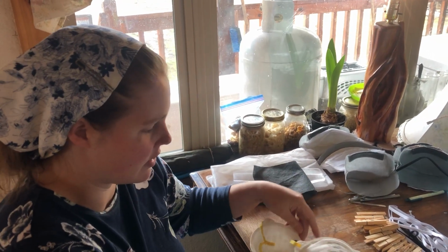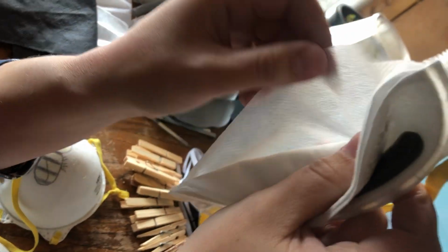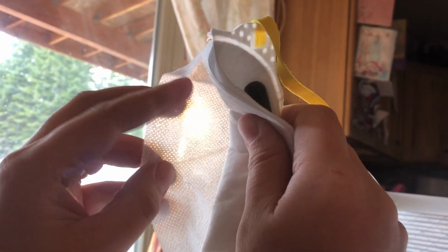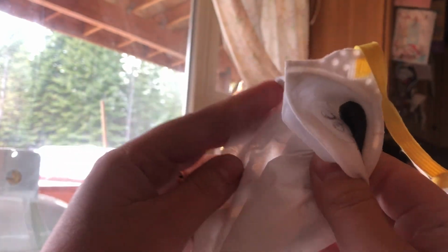So I was like, okay, well, how are they making these things? So I dissected mine here. It's like, okay, what have we got? We have a real thin layer of something that, if you look through it, you can see that it's like a mesh. It's like a pressed fabric, interfacing. It's not like a knit or a woven fabric. That is your outer layer. It reminds me a lot of a reusable grocery bag. So I was like, okay, well, that's my outer layer. Then we've got a really thick, really stiff layer of interfacing type of stuff. Also a pressed fabric, not a woven or a knit. Okay, get that one out of the way.